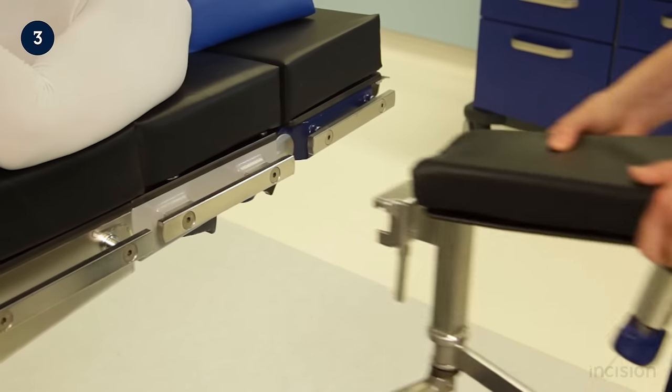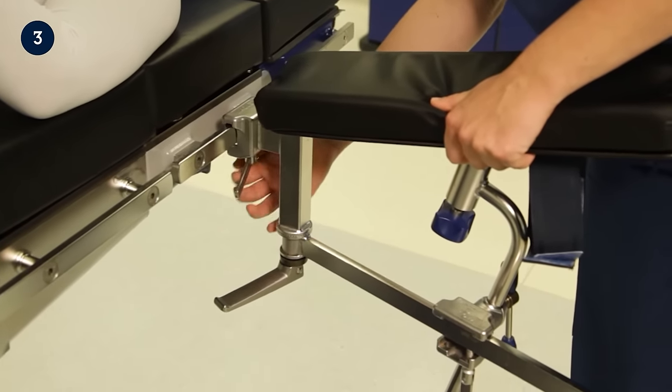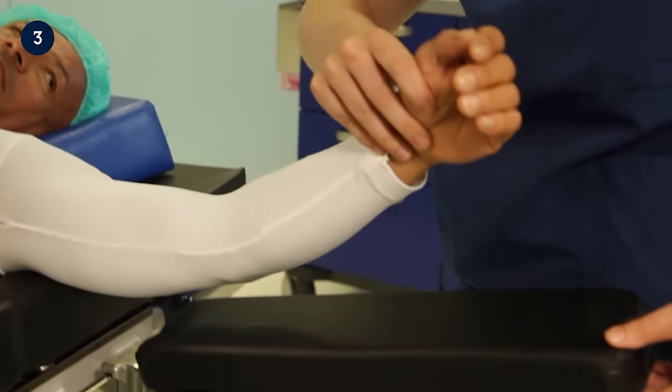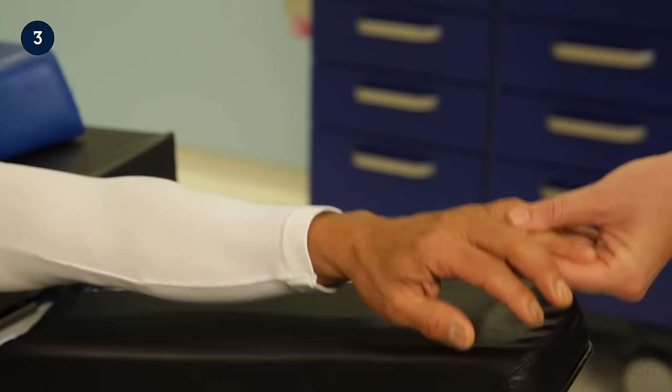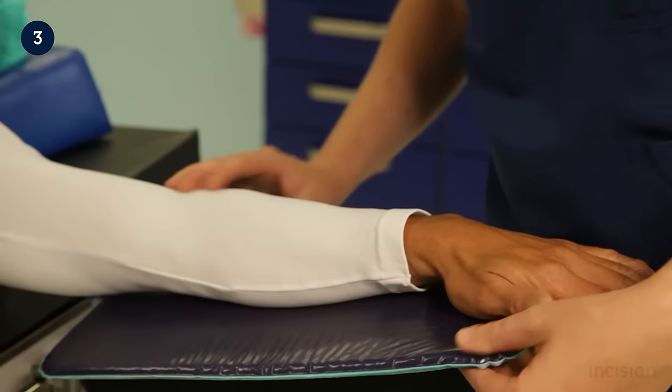The awake patient model has just been transferred to the surgical table and an arm support is attached. The patient's arm is placed on the arm support with care taken not to stretch or compress nerves. If needed, additional padding may be placed between the patient and the arm support.